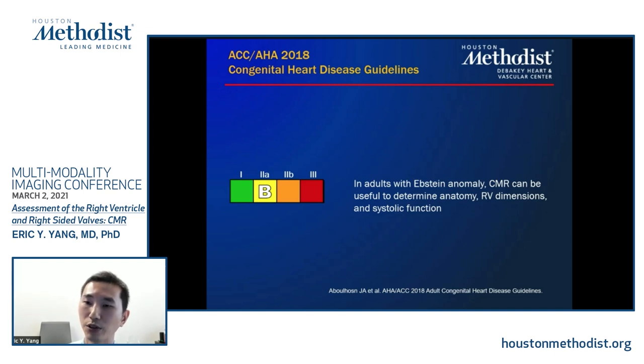This is just harking back to, in fact, when it comes to the right ventricle, one of our favorite customers is the congenital heart folks. And in congenital heart disease, many of the things that get affected affect the right ventricle. It's actually recommended not only for Ebstein's, but many different congenital heart diseases for assessing the RV and RV function.